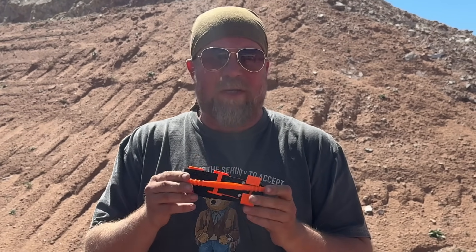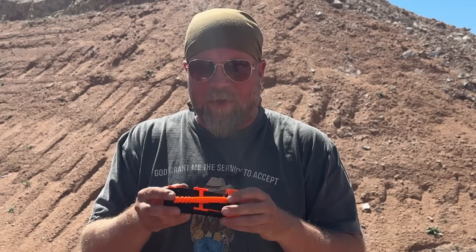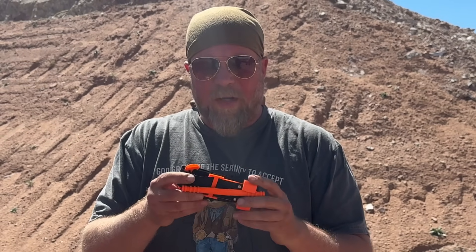Hey guys, welcome to an episode of InRange. We're here at CQB Brutality 2024, and on the stage we actually have a tourniquet application. These tourniquets are particularly interesting — this is referred to as the Gaza tourniquet, and it is 3D printed, stitchable, and able to be made in areas where you normally couldn't manufacture what you would think of as a professional-grade tourniquet.